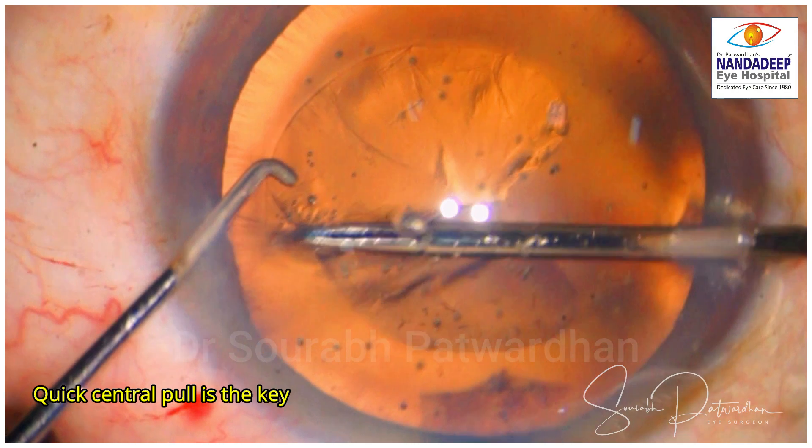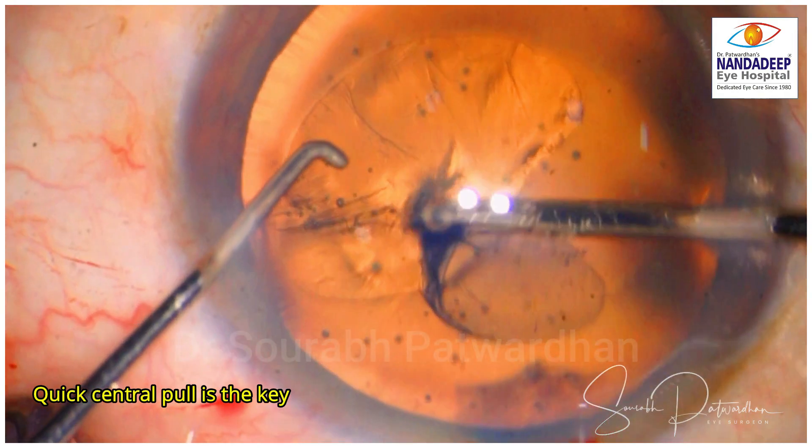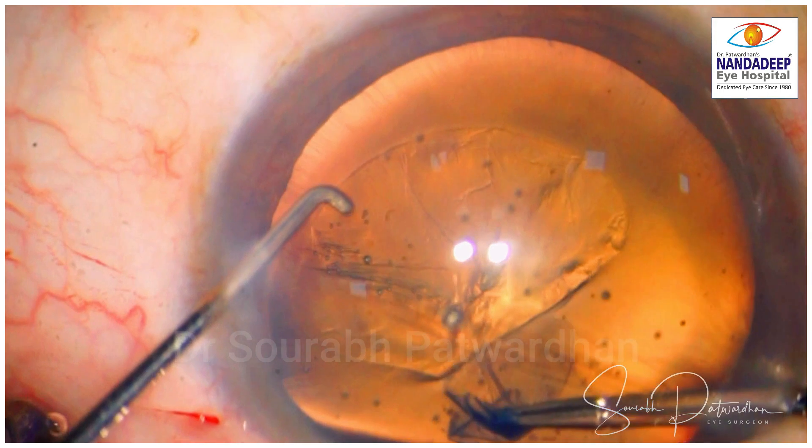Once it is pulled quickly, you can see the capsulorhexis tear come inside, further extension is prevented, and we can get a good, complete capsulorhexis.